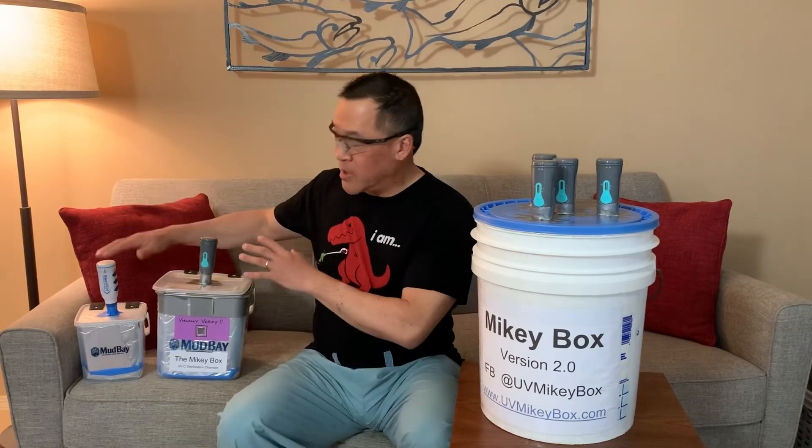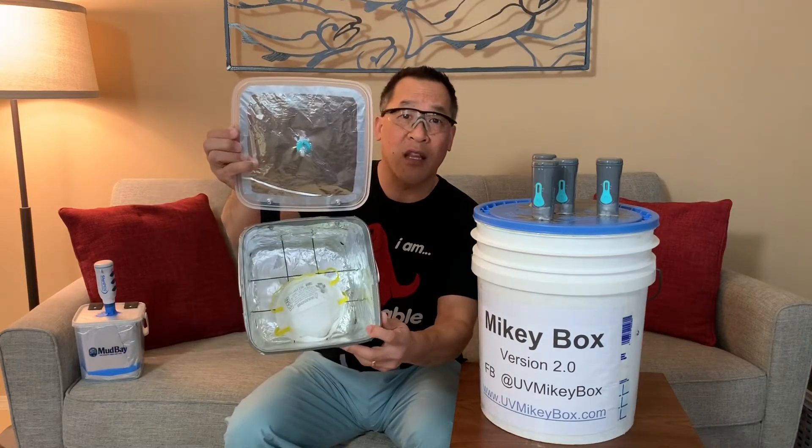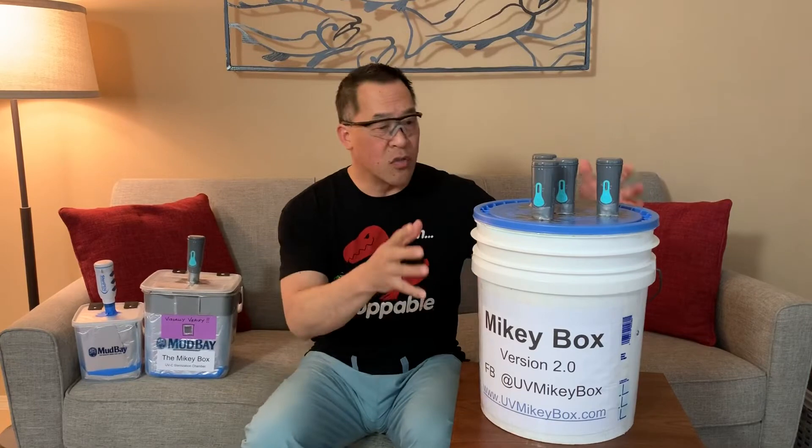Hello, I'm Michael Chu with MikeyBox. This is the day four update of our efforts. We started with the smaller MikeyBox that can handle just one N95 mask at a time and we've enlarged it to version 2.0 in the ubiquitous and very humble five gallon bucket.